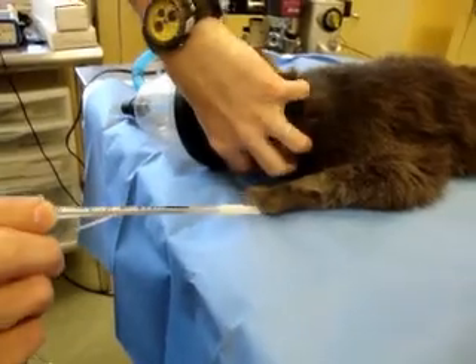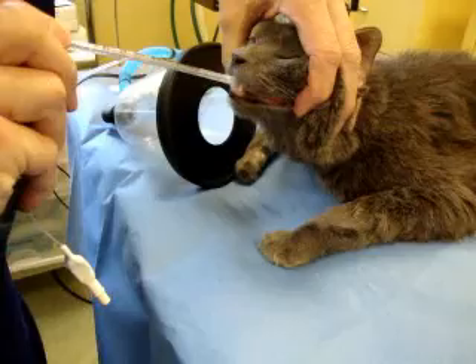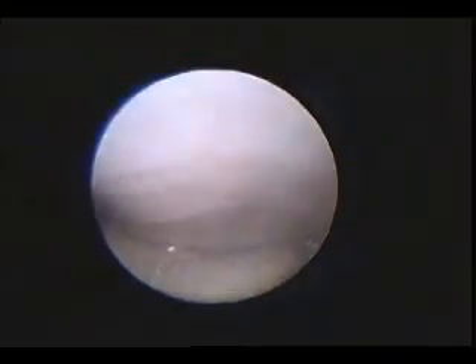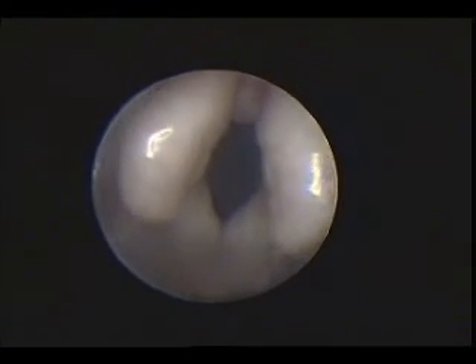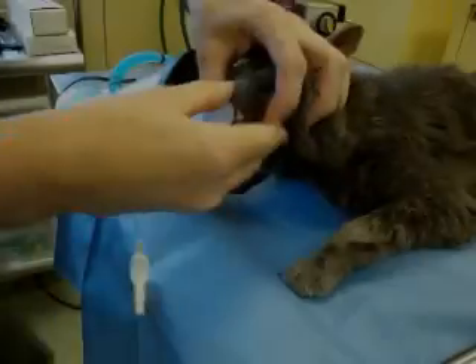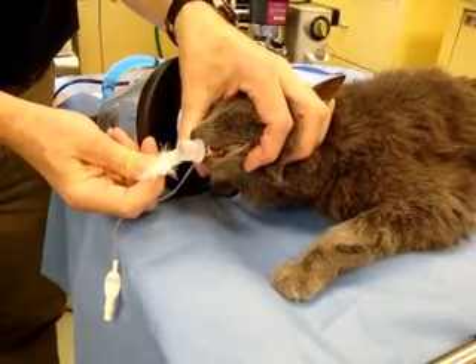Looking through our stylet, we're able to intubate the cat single-handedly. Going back over the base of the tongue, flipping the soft palate out of the way, getting a full view of the glottis and into the trachea. And we're intubated, as demonstrated by vapor or by our bird feather.